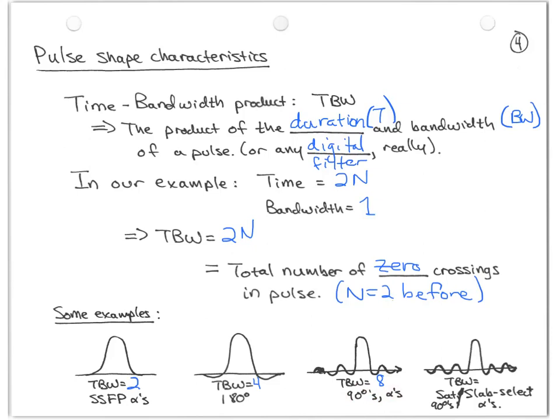And the final one is time bandwidth equals 12, and these guys are used for slab saturations, which are always 90 degree pulses, right? Those are pulses wherein we want to kill off the signal in a certain spatial location, and so we excite that signal with a 90 degree excitation, so that kills off the MZ component, right?